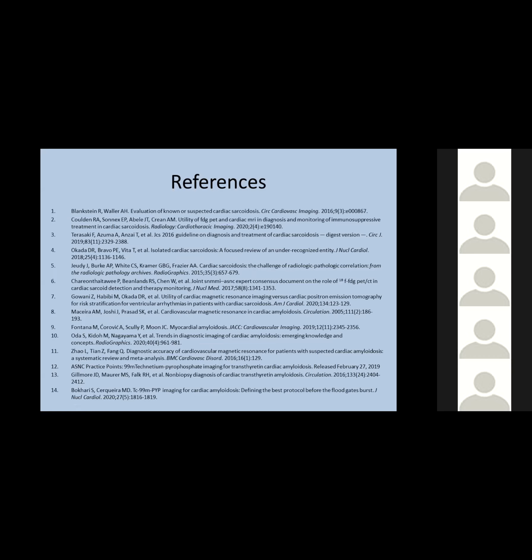Yeah, no, Matt, superb overview. Really enjoyed it. Nice, concise argument for CMR. So I have 3 comments. Maybe you could just answer them in less than a minute. The one question I have is, we see a young patient, 50-year-old, complete heart block, and they need a pacemaker. We try to rule out, I mean, we should think of sarcoid. If they get a device, say a pacemaker, how can we do a CMR after a device, ICD or pacemaker?